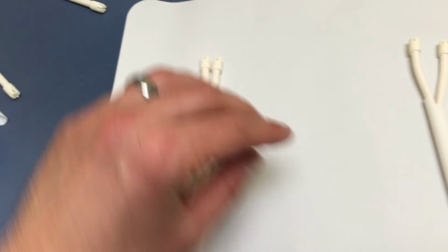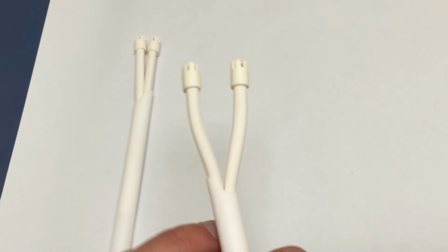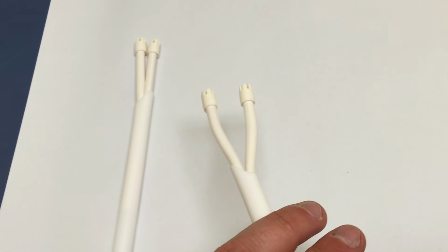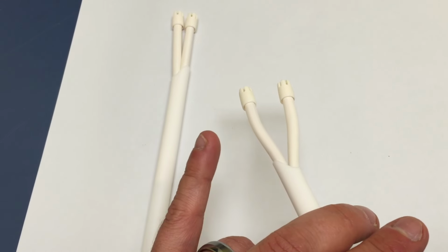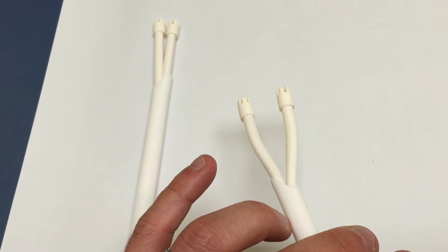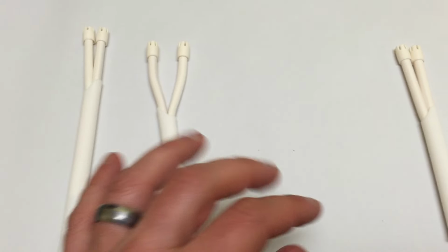The other thing it's good for is if you spread out the two saliva ejectors like this and place it around the lower quadrant to provide isolation. It retracts the tongue pretty well, keeps it away, and has a lot of suction power around the tooth, or two teeth actually, if you want. I'll show you a clip of that in a second, so you can see how it works.